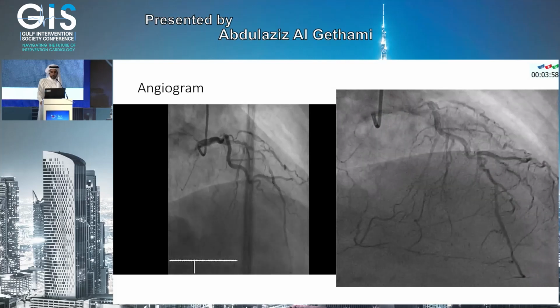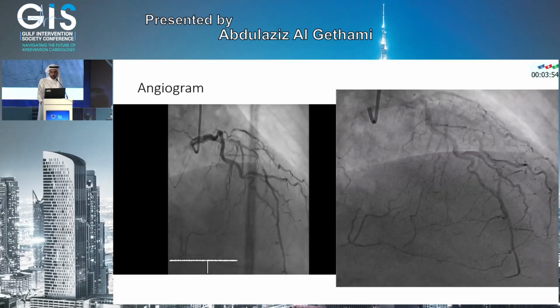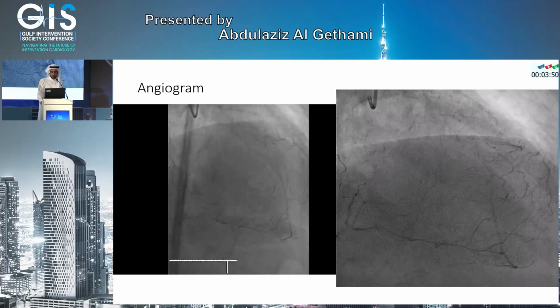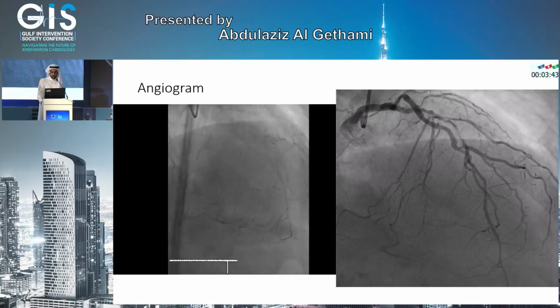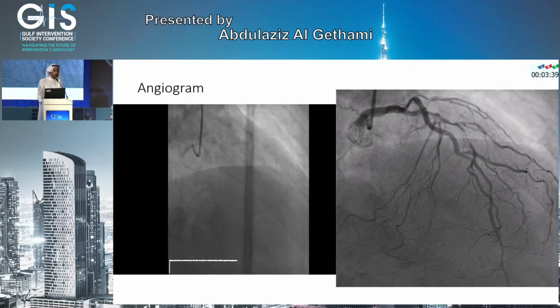You need to size your vessel, you need to see your stent after. Regardless of the imaging you're going to select, either OCT or IVUS, if you want to be a multivessel PCI operator, and if you want to be a complex PCI operator, you have to have imaging in your system. So I guess Carlo also raised, yeah.